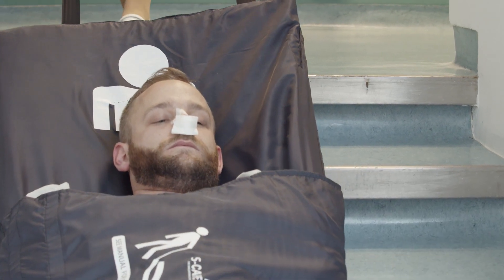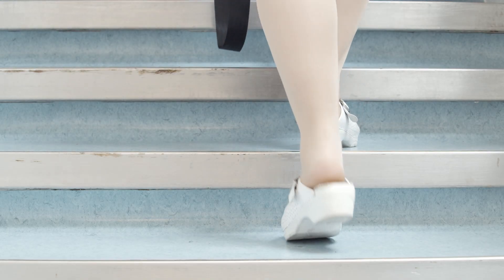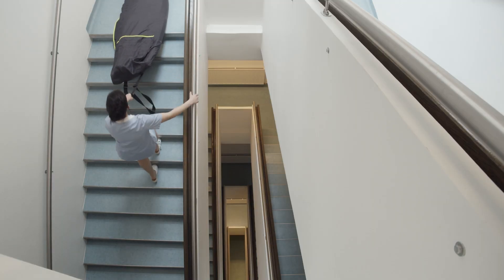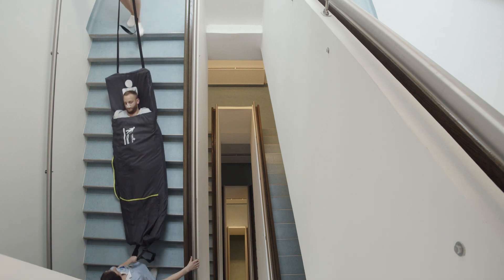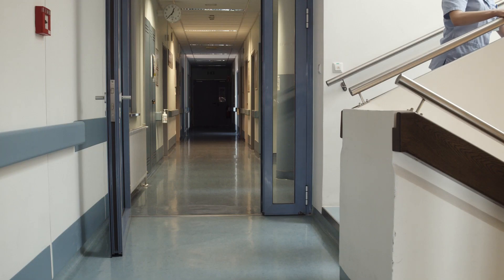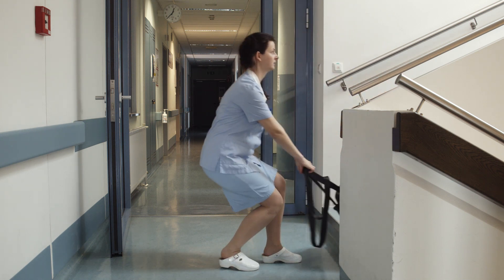Always have a firm grip on the railing and keep your foot in contact with the mat at all times. Maintain eye contact with the patient and descend the stairs gradually, step by step. Do not skip any steps. The patient may be evacuated by a single person; however, the rescuer should never overestimate his or her capabilities. Evacuation down the stairs is potentially dangerous. You need to be sure that you can control the weight of the patient along the entire length of the stairs.